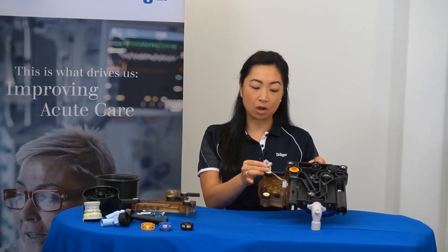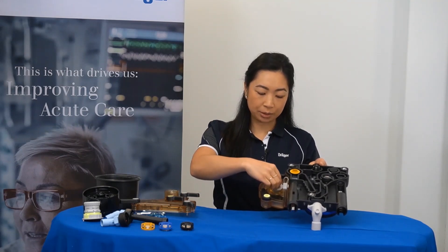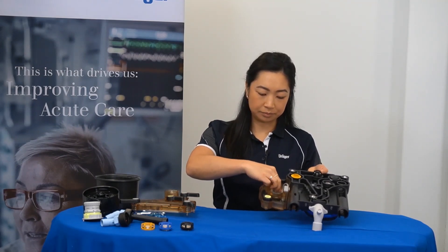Begin by returning the oxygen sensor cap to its original position, taking it out of the holder and screwing it back in. For devices that have an oxygen sensor, replace that at this point.